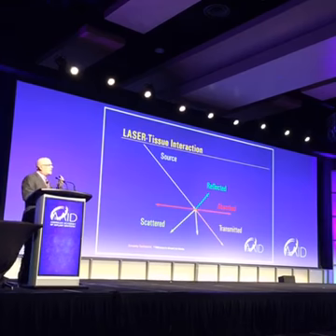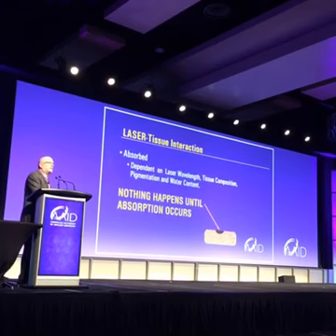So, laser interaction can go through a host of different ways. It can be reflected, it can be transmitted, it can be scattered. If any of those happen, nothing happens. So that's why, if you shine one of your little handheld lasers at the screen, it doesn't burn up, because that's not where this particular wavelength is absorbed. Nothing happens until the wavelength is absorbed by your target tissue.